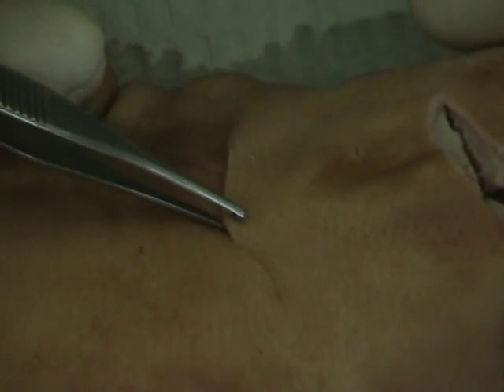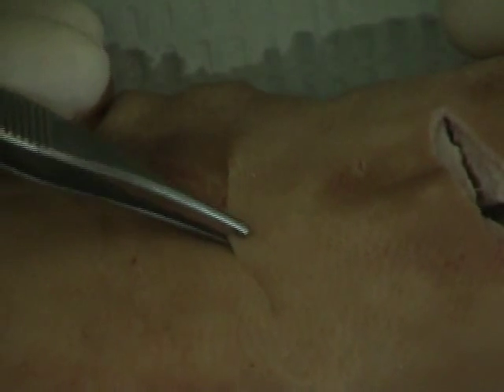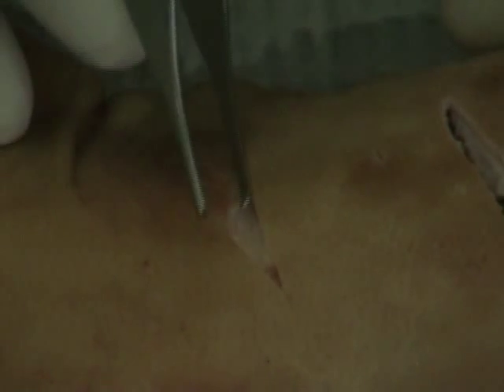So you need to make sure you're right in the middle, you're lined up properly, and everything's going to appear pretty flat. So I kind of pull one side, and then I kind of put a little mark on the skin on the other side. So I know pretty much where I'm going to be putting my first stitch, and on both sides, to tend to minimize. And then I go back, and before I tie this off, I'll actually go check to make sure that this is going to work out okay.